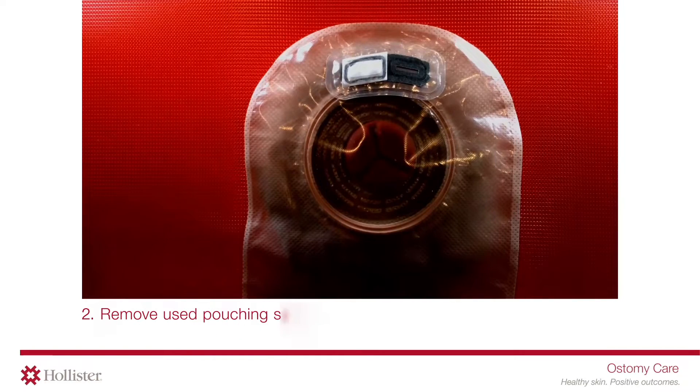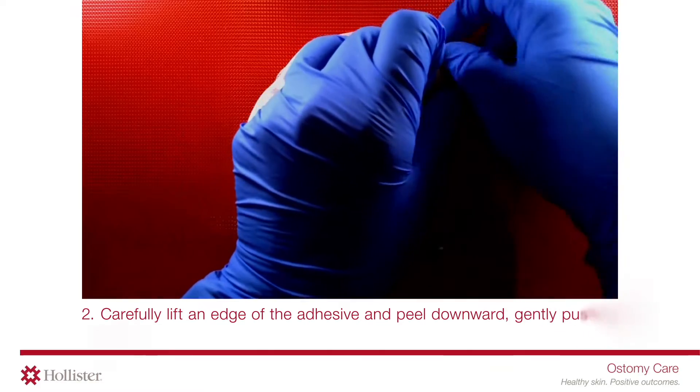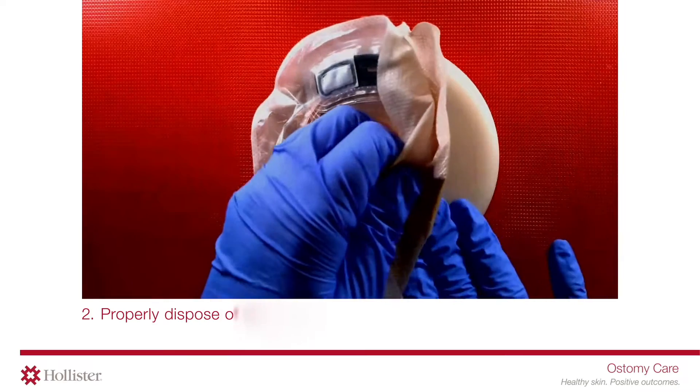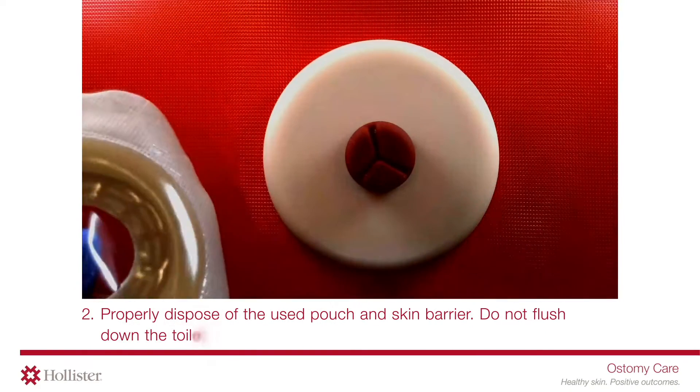Remove the used pouching system. Carefully lift an edge of the adhesive and peel downward, gently pushing the skin away from the skin barrier. Properly dispose of the used pouch and skin barrier. Do not flush down the toilet.